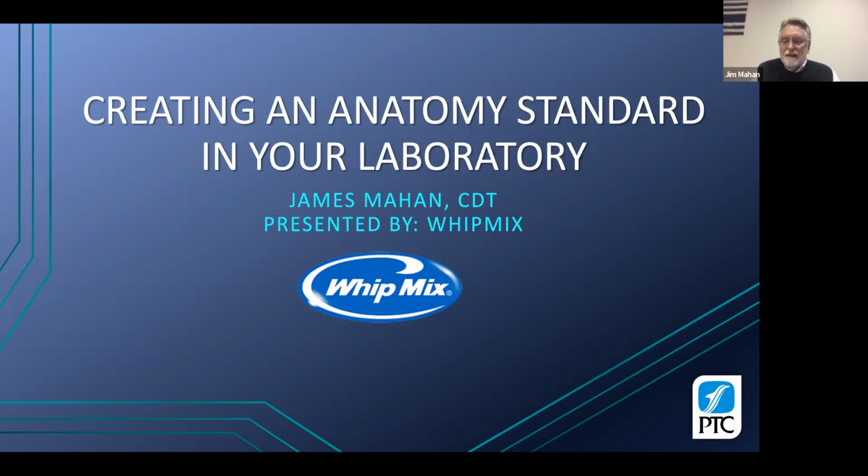And some labs will say, well, we have the PTC teeth, they look like this, and that's what we use. And I say, okay, so how do you use those? Well, when somebody comes on board, we teach them the anatomy and we show them the teeth, and we say, when you make your crowns, we want them to look something like this. I say, okay, well, that's something, it's good. And who enforces that standard that you're establishing?